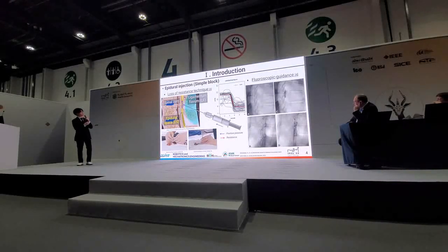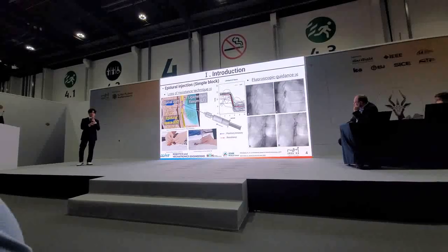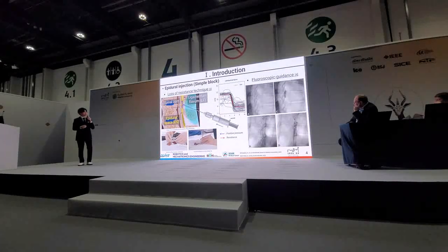And X-ray-based fluoroscopic guidance is also a major approach to confirm the position of the needle. In the epidural injection procedure, interventionalists take X-ray images each time, and based on the clinical margin, they estimate the depth of the needle during the procedure.